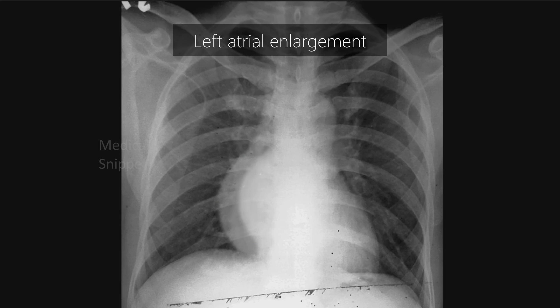Usually, the left atrial appendage is not seen in the chest X-ray. When it is enlarged, it is seen as a convexity below the pulmonary artery shadow.